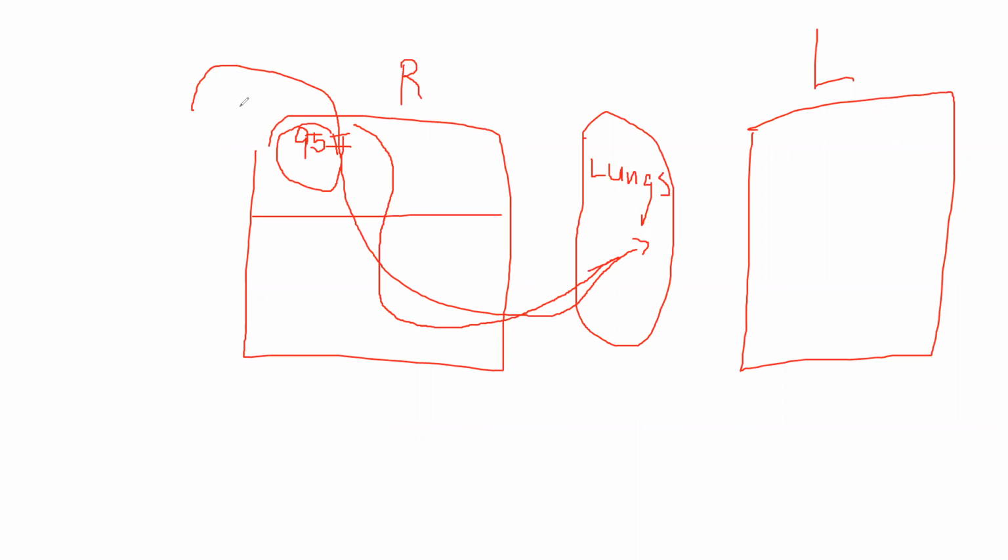Supposing now that I injected a 10 cc solution of 95 degrees, this particular part of the catheter is now going to detect the change of temperature by the arrival of this bolus of fluid that you gave right over here. The time, therefore, that it traveled from here to here is going to be computed as your cardiac output.